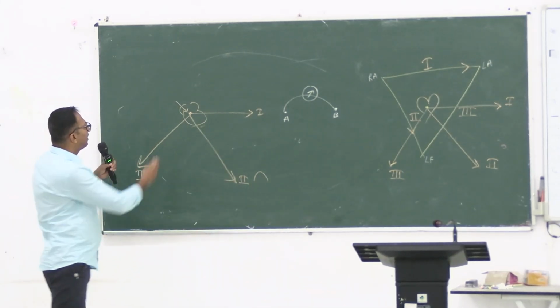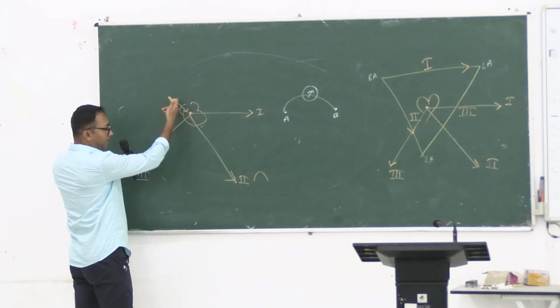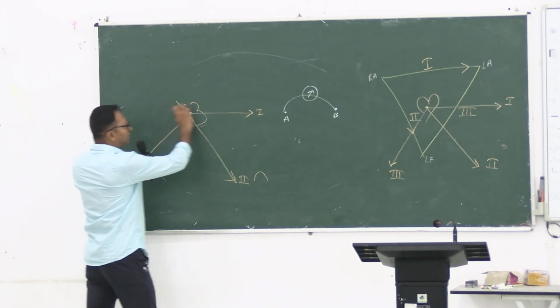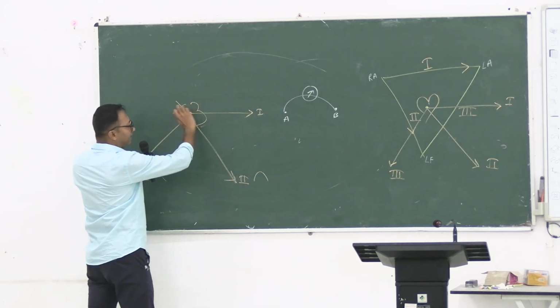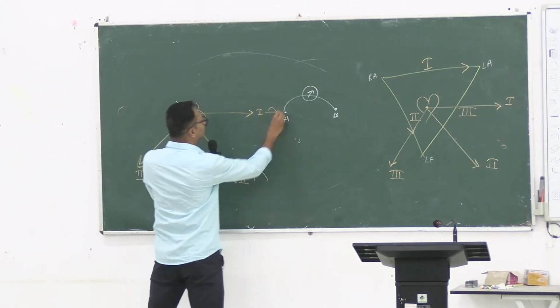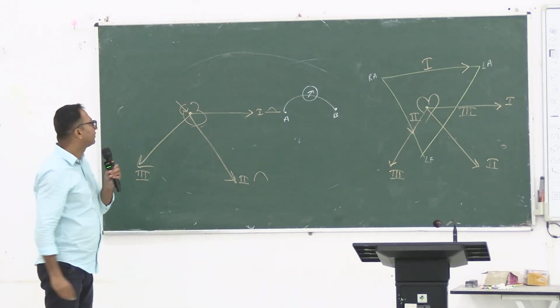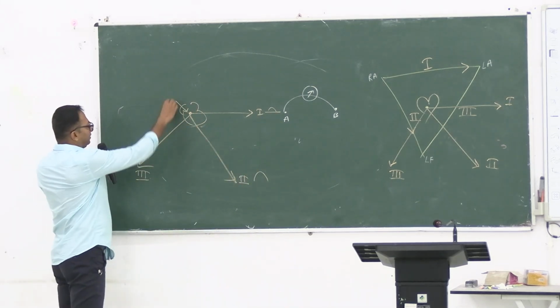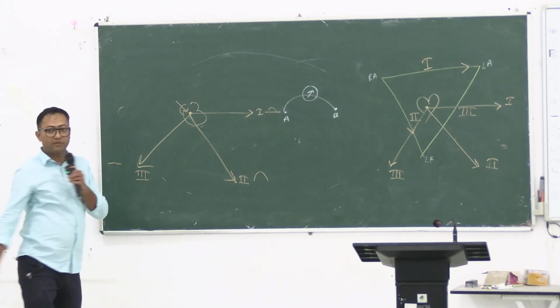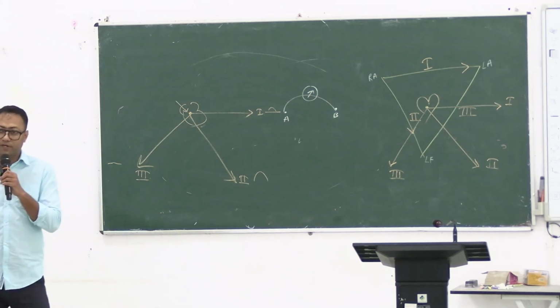And आप इसको, as you are considering this as vector, it has got a component here also, but small. So you get a small P wave here, right? And यहाँ पर almost no or slight P wave. Getting my point?